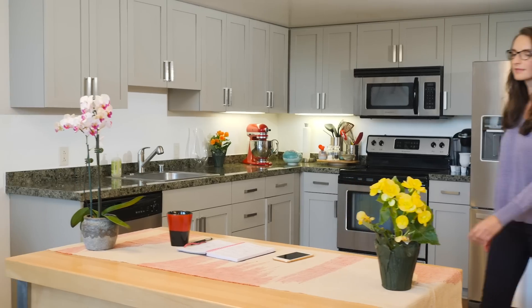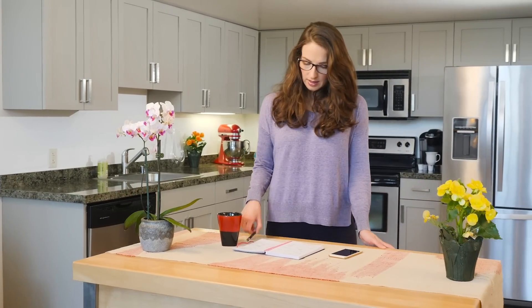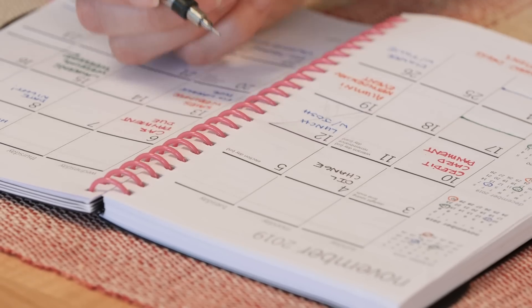As you get older, your vision can change sooner than you think. Looks like you may be ready for a new pair of eyeglasses. Now you'll have to call the doctor, clear a spot in your calendar, and still wait weeks to see clearly again.